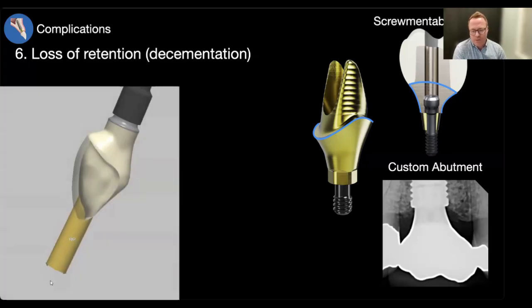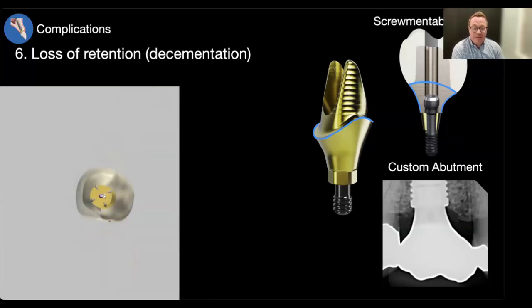And of course, today with things like angled screw channels, it really allows us to not need to cement. And that's why I haven't cemented in many, many years. And just again, personal preference there. But we know that excess cement can be a problem.